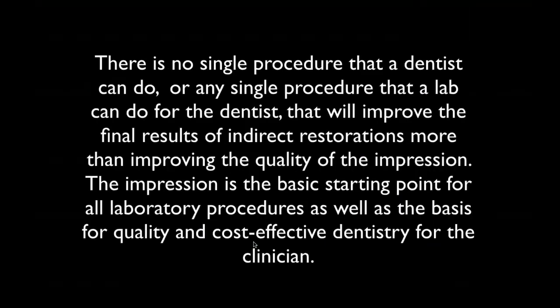So one of the things that we talk about is accuracy. And this is a saying I have. There's no single procedure that a dentist can do, or any single procedure that a lab can do for the dentist, that will improve the final results of an indirect restoration more than improving the quality of the impression. The impression is the basic starting point for all laboratory procedures, as well as the basis for quality and cost-effective dentistry for the clinician.